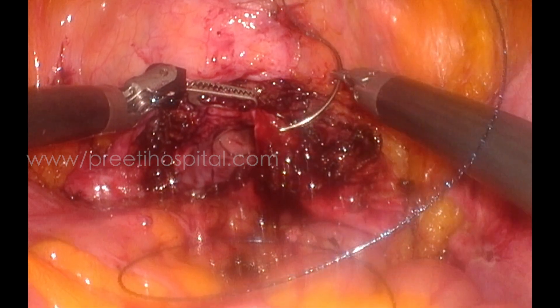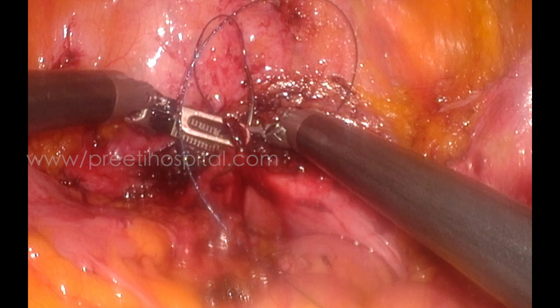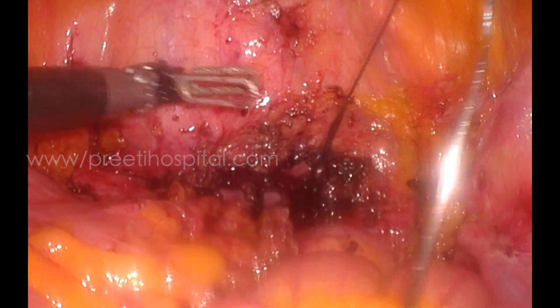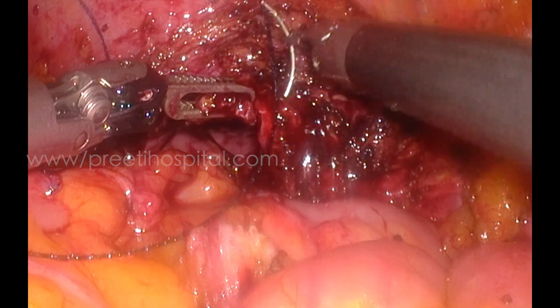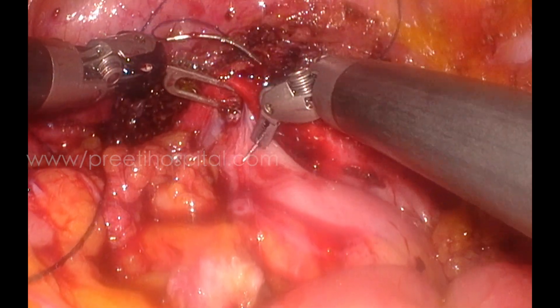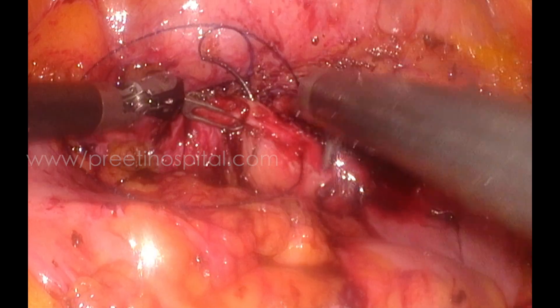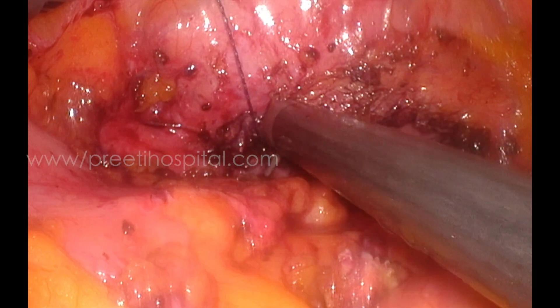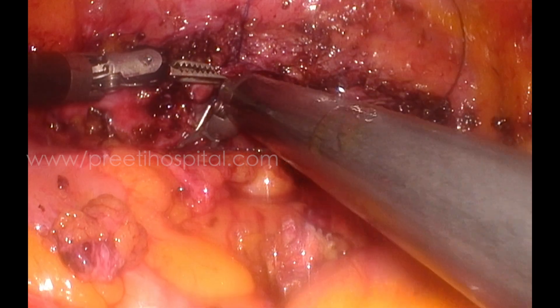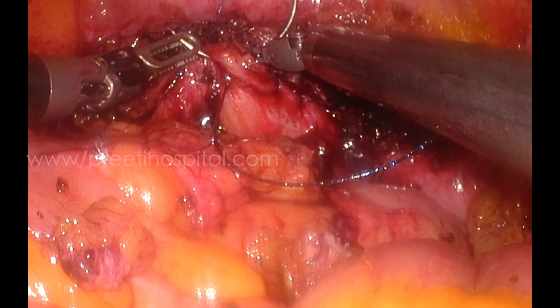For suturing I used 2-0 V-lock, and it was very easy to hold the suture. The principles of suturing from multiple laparoscopic teachings proved very useful — the method of holding the suture, pulling it slowly, progressing without tangling, and holding firmly with the left hand. The left-hand instrument holds tissues very firmly. Because of previous laparoscopic experience I could gauge the required pressure, though I don't think it is very difficult for any beginner who knows surgical principles. The key principle here is horizontal opening, horizontal dissection, and horizontal closure of the fistula repair.